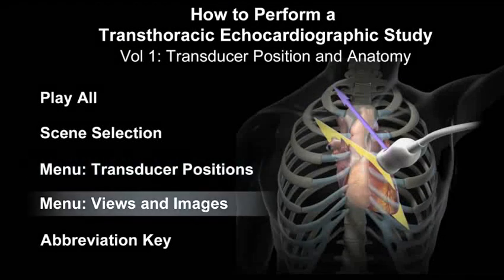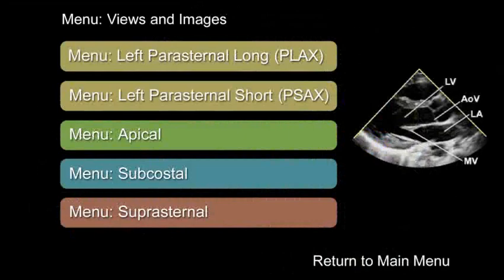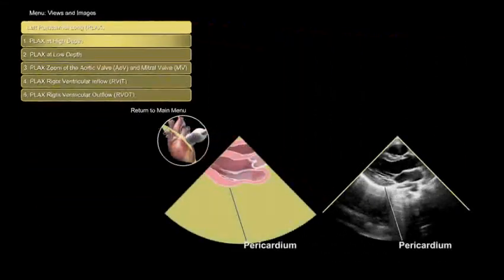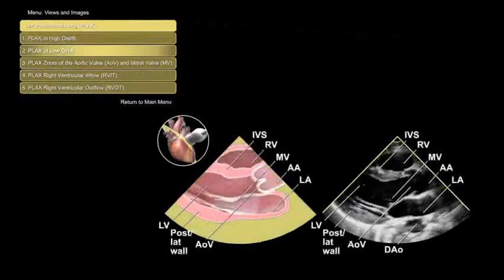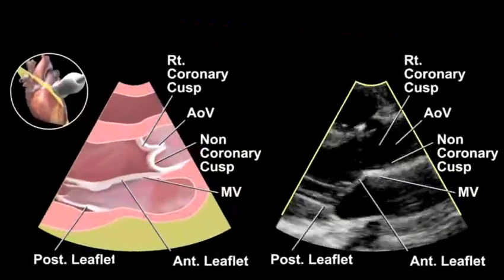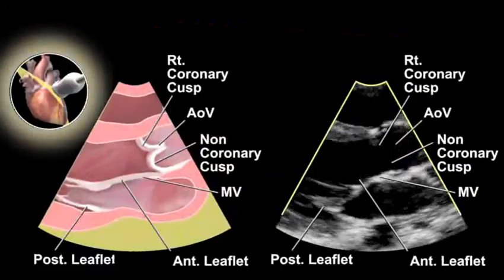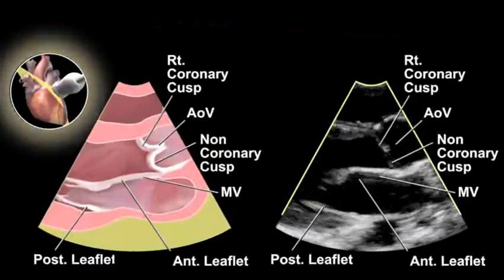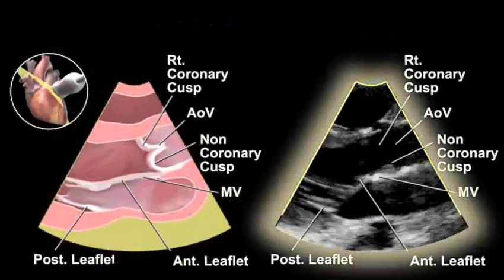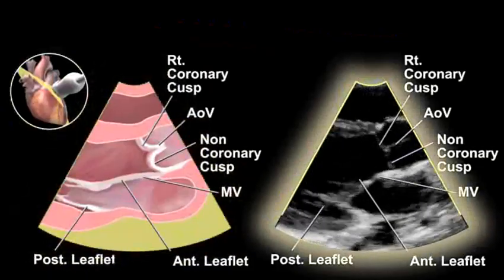The Views and Imaging menu allows the user to navigate from a particular transducer position menu, such as left parasternal long, to specific images acquired within that window, such as PLAX high depth, PLAX low depth, and PLAX zoom of the aortic and mitral valves. Each animated loop shows a finder image in the upper left that depicts the transducer position, an illustration of the sectional anatomy of the heart on the left, and the echo image with labels on the right.